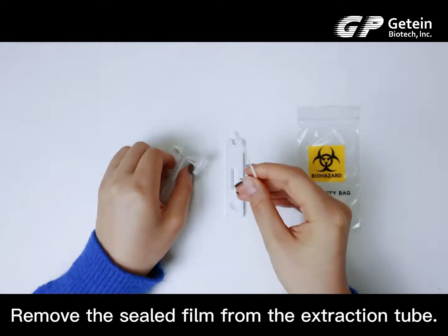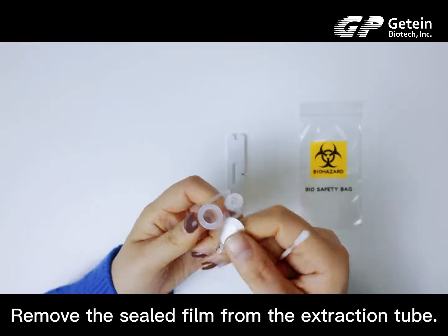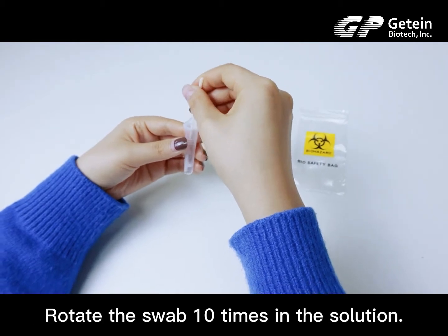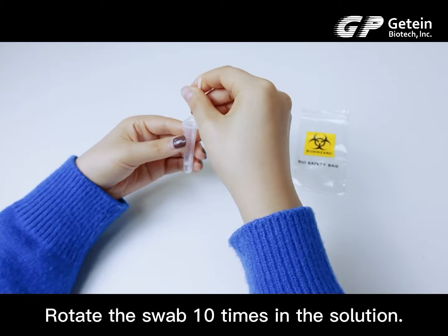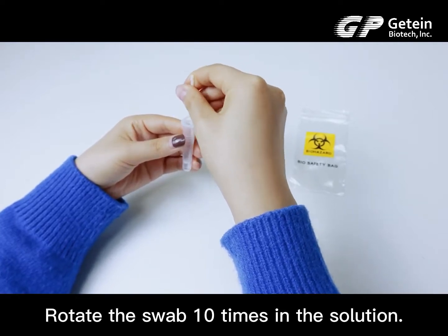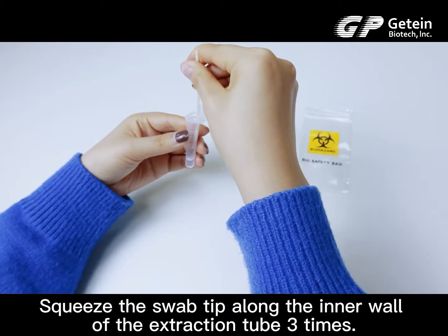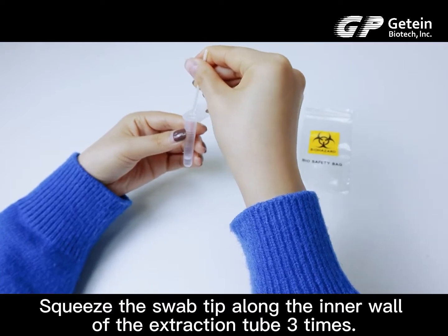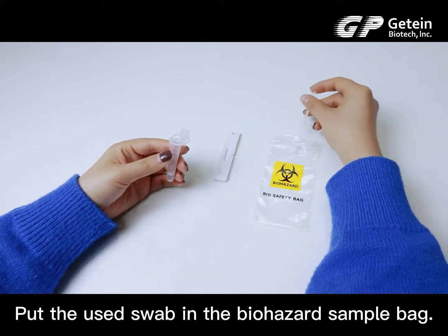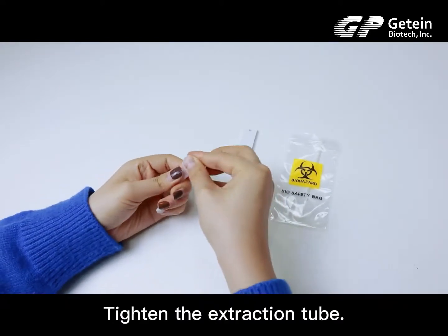Remove the sealed film from the extraction tube. Then insert the swab into the extraction tube. Rotate the swab 10 times in the solution. Squeeze the swab tube along the inner wall of the extraction tube 3 times. Put the used swab in the biohazard sample bag. Tighten the extraction tube.